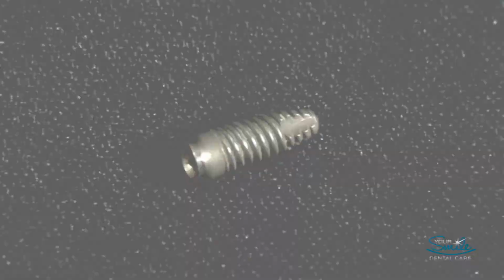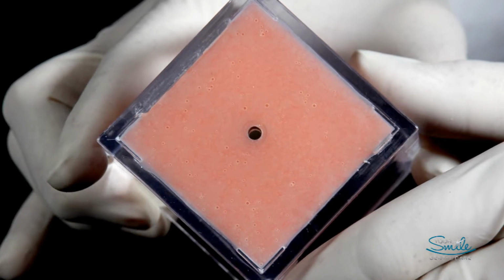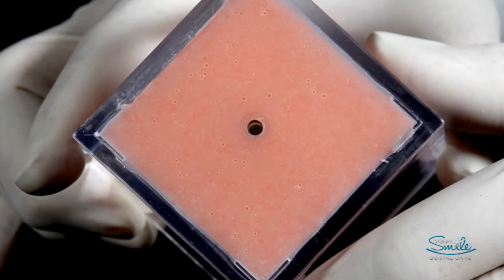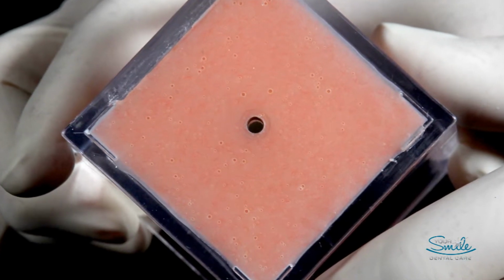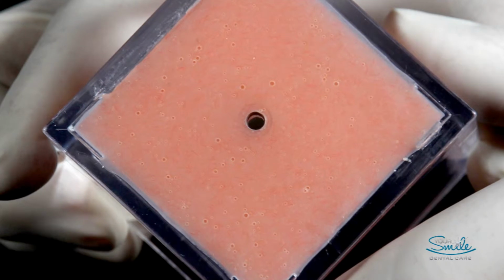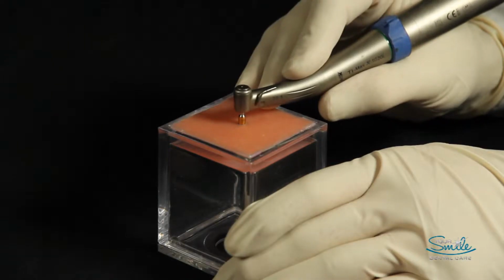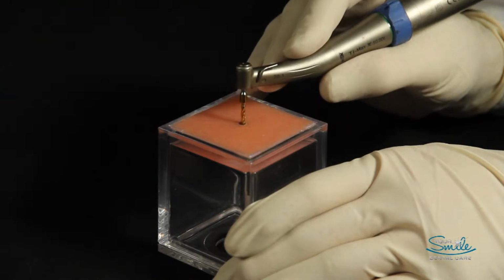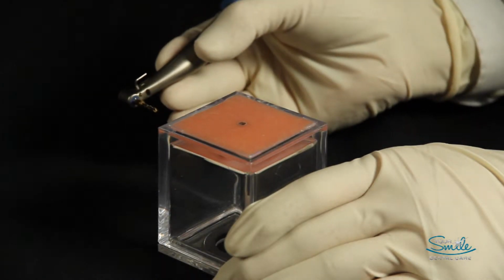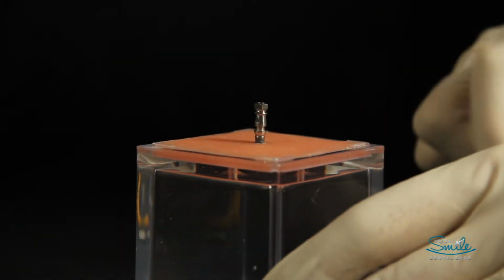to last for life. What this model cannot show is the opening up into the area designed to receive the implant. But what we have here is a very small hole in the gum and jaw, similar to what would be made in the mouth. This is prepared very precisely and carefully under rigid sterile techniques to make sure that the living cells around the implant are not damaged in any way. As a bonus, this translates into minimal discomfort afterwards. The implant is inserted with a variety of insertion tools, as we will see here.